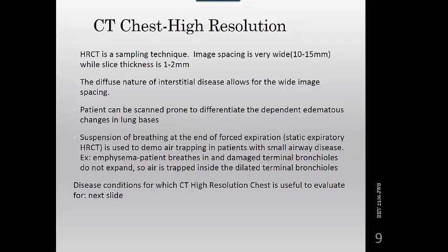So anywhere from 2 to 5 slices are usually taken at the lung apices, and then you move down to the mid-thorax, take 2 or 3 slices there, and then you go to the base of the lungs and take a few slices there. And that's all you do with that. No contrast, no major slices through there, no coronal cuts. Well, you may turn some coronal cuts in, but a very small sampling is all you're doing.